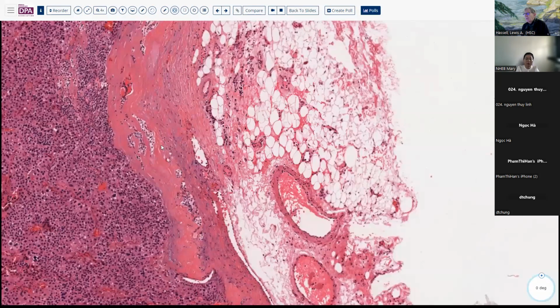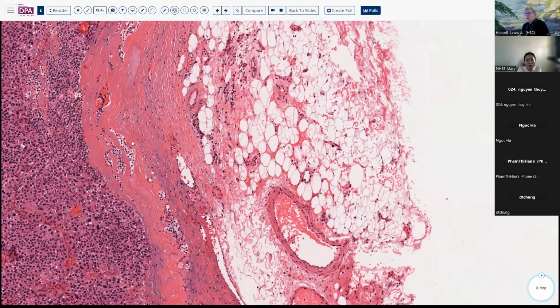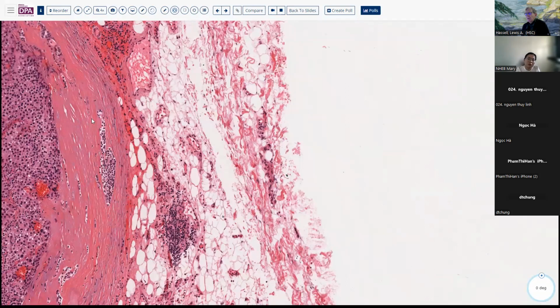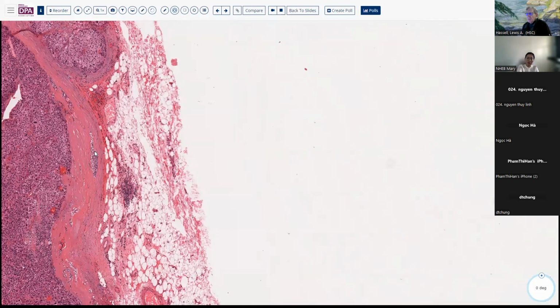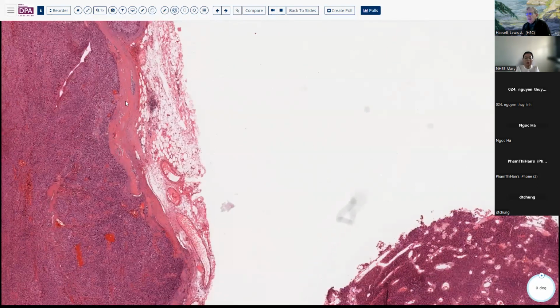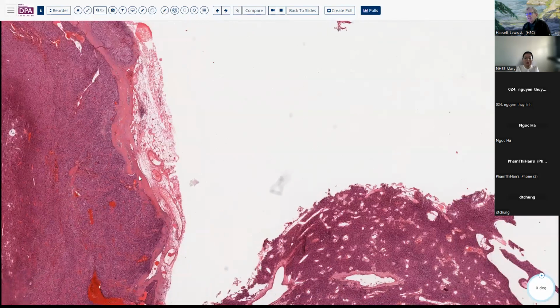Now, in this particular gland, we do have some little islands of parathyroid tissue that are compressed and entrapped within the capsule. And so this is one feature in parathyroid carcinoma, is that it tends to make a thick capsule that compresses the adjacent parathyroid tissue. And just like we can use that in the thyroid, this thicker fibrous band or capsule can be a suggestion of malignancy.